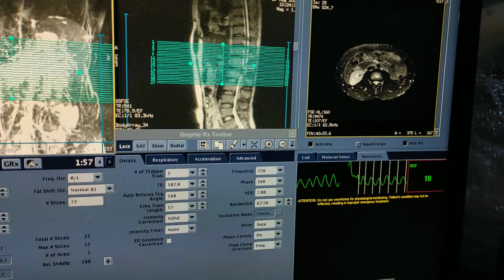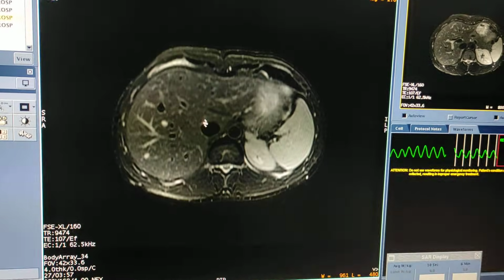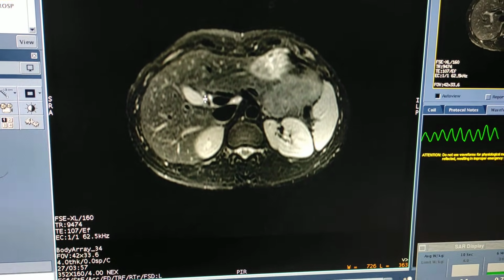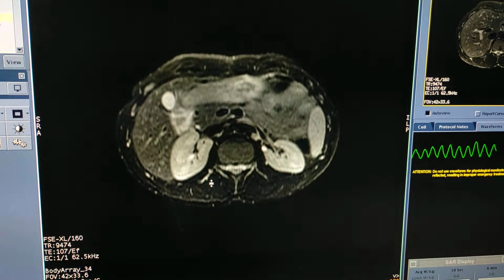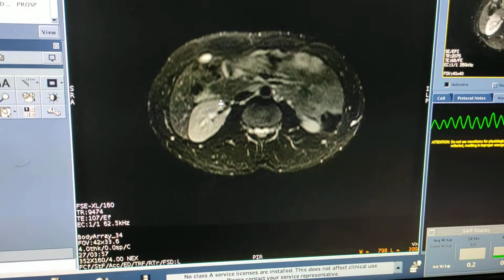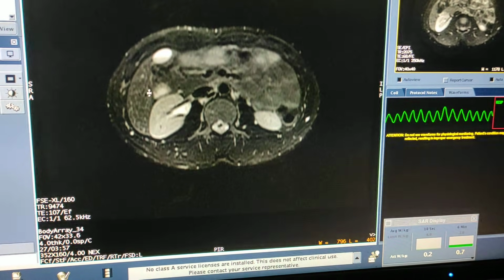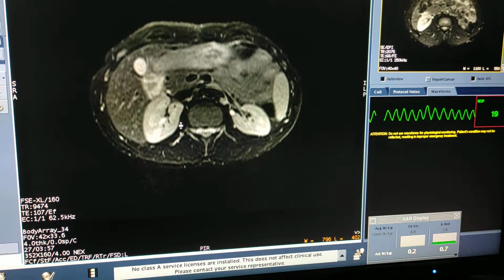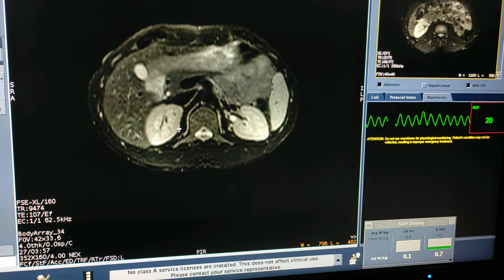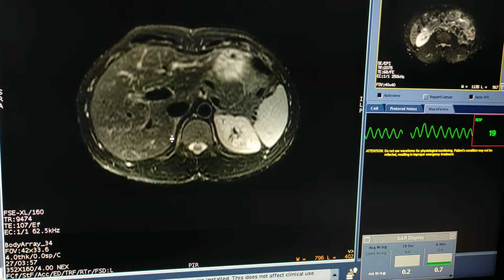So you can see this is axial FST2. I will show you in a zoom image. This is axial FST2. This is gallbladder. This is cystic duct. This is CBD. Here CBD is draining over here. यहाँ पे ड्रेन हो गए. ये tiny है CBD है. यहाँ if there is some stone, it will be in a black in color. Okay. There is no stone in the gallbladder as well as in the CBD.